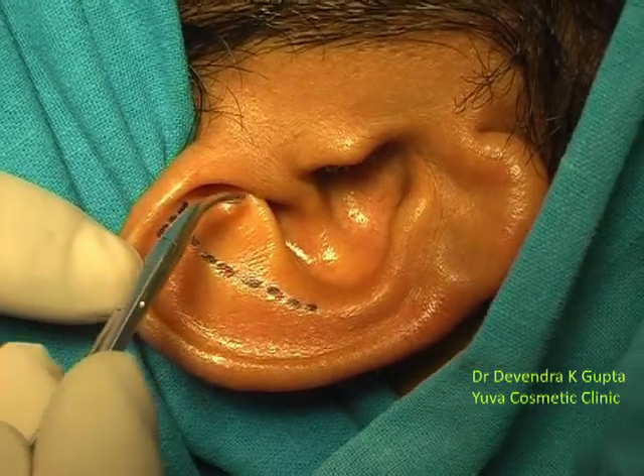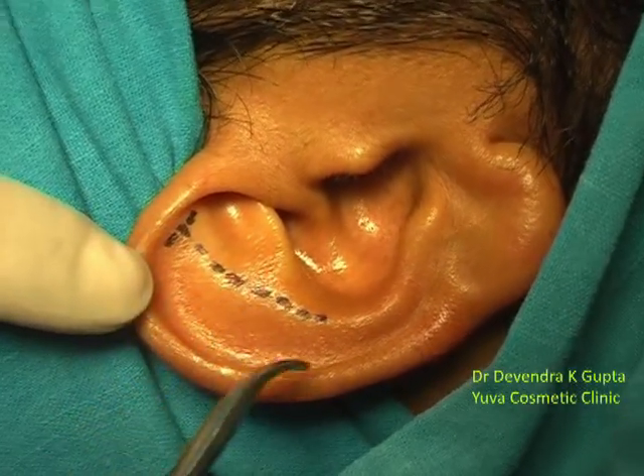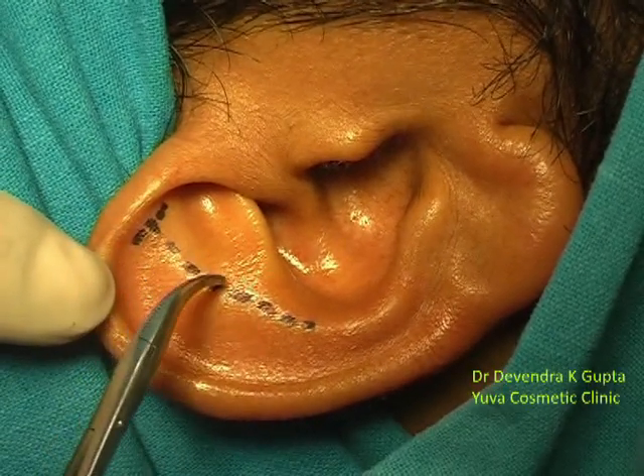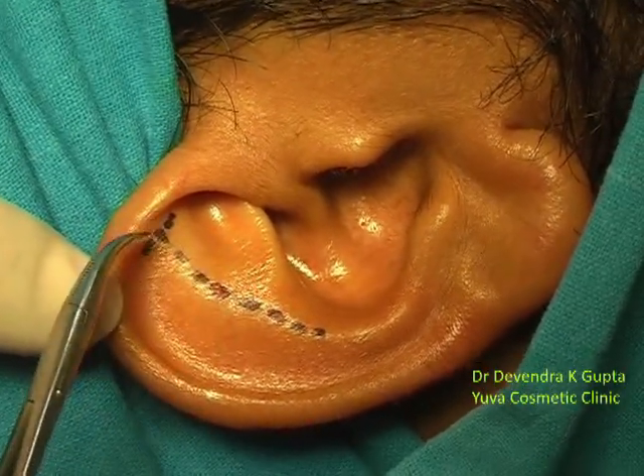Here you can see the triangular fossa. This is the helix, and this is the anti-helix border. However, the upper half of the anti-helix border is not well defined.